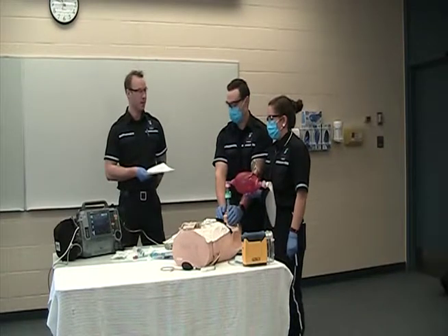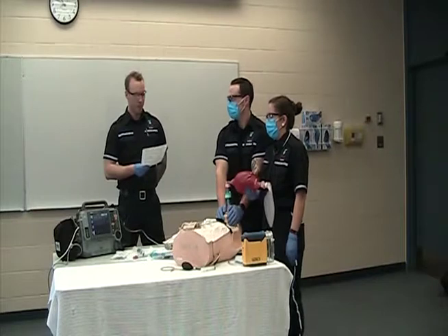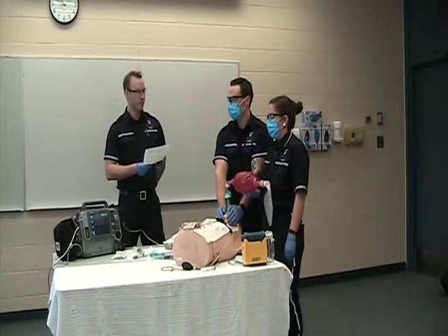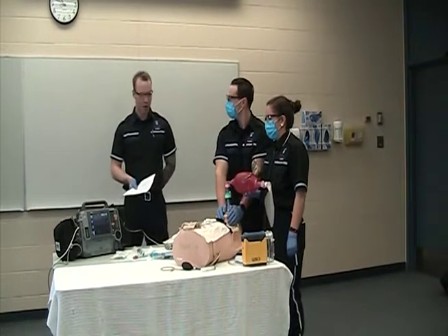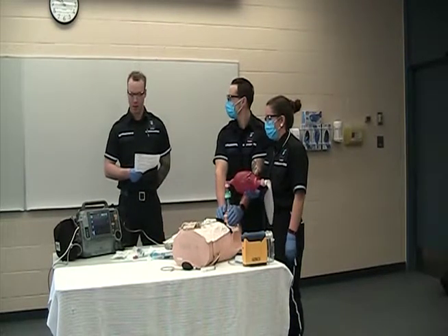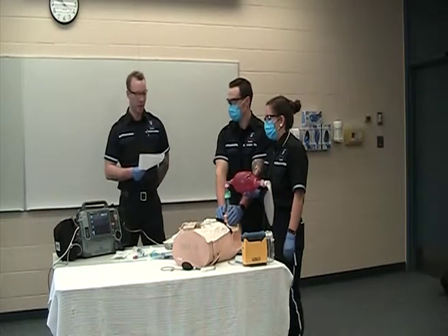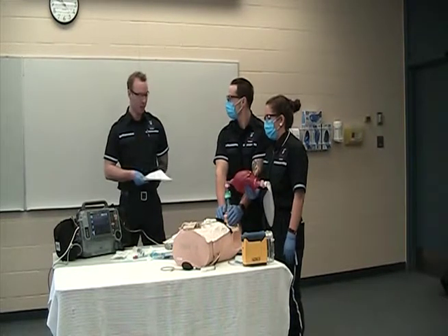Patient has been ramped into sniffing position. We have our equipment prepared. We have our PPE, gloves, masks. Monitor is on with our ECG connected. Vital signs, our BP is attached, SpO2 is attached. Suction has been tested. McGill's near the patient's head.